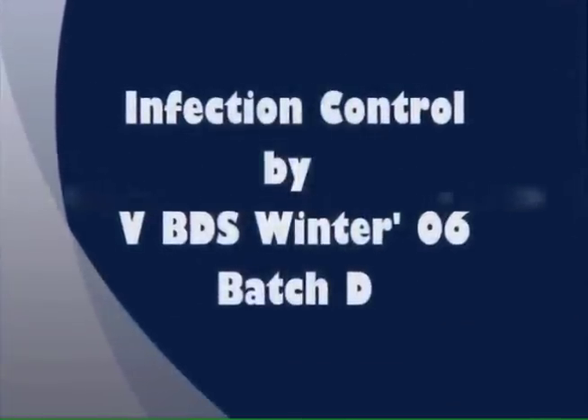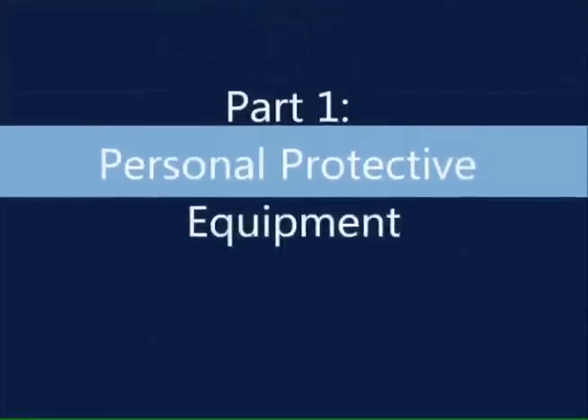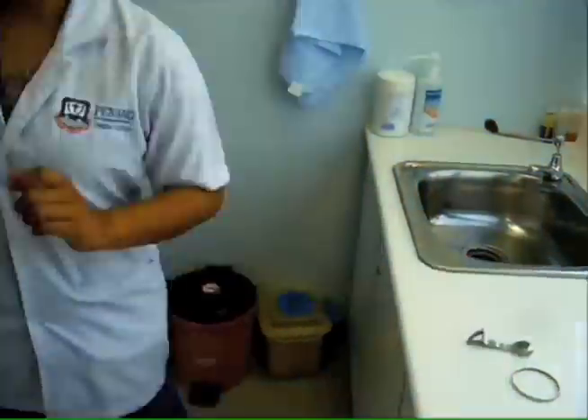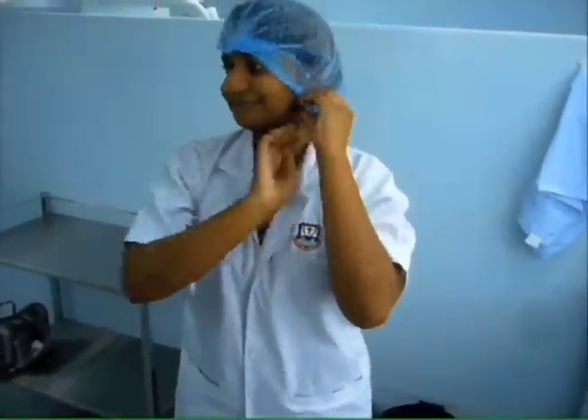Infection control by 5th tier BDS Winter 06 Batch D. Personal protective equipment — PPE Donning. First, make sure your hand and arms are free from watches and jewellery. Next, wear the head cap and make sure your hair is nicely tucked under the head cap.